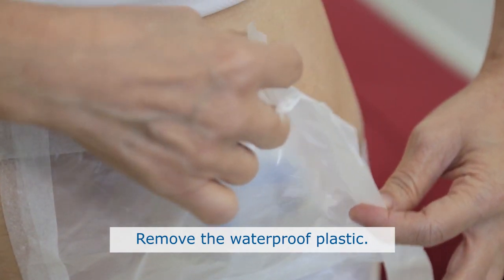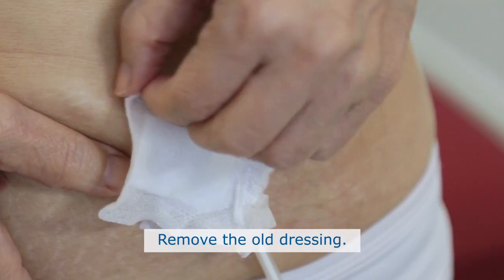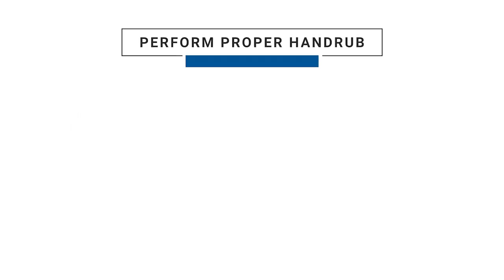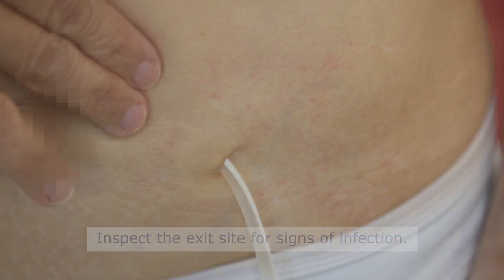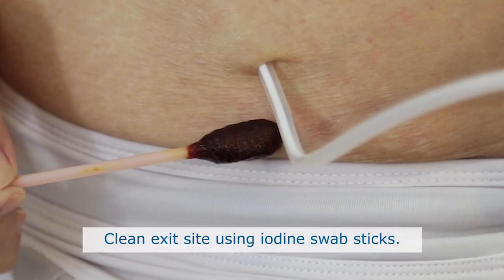Remove the waterproof plastic and remove the old dressing. Perform a proper hand rub as shown earlier. Once your hands are clean and dry, inspect your exit site for signs of infection. In case of any signs such as redness, tenderness, discharge or pain, please contact your PD unit and record the condition in the PD record book.